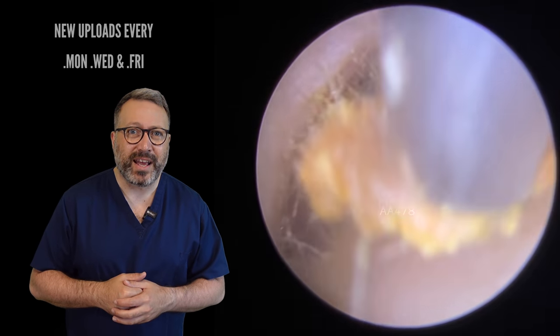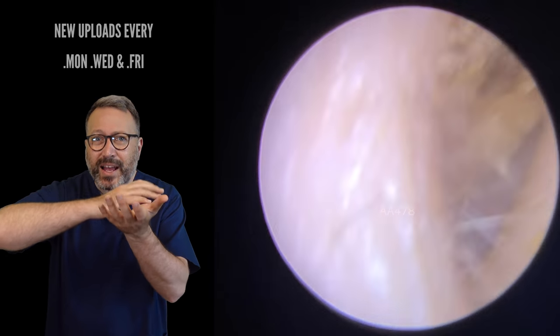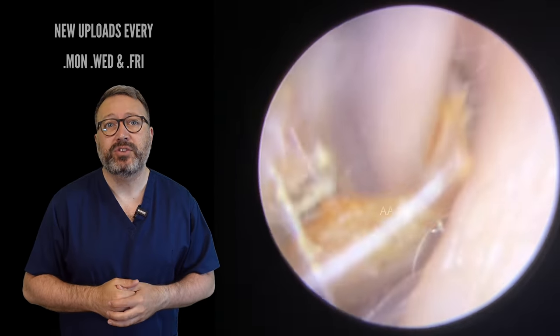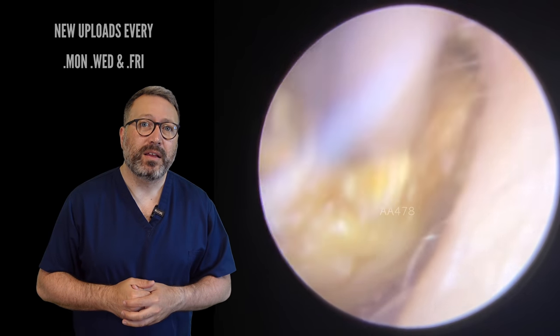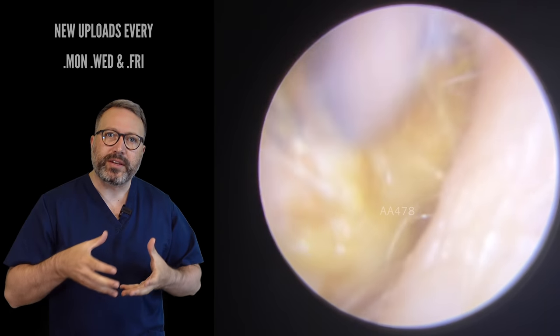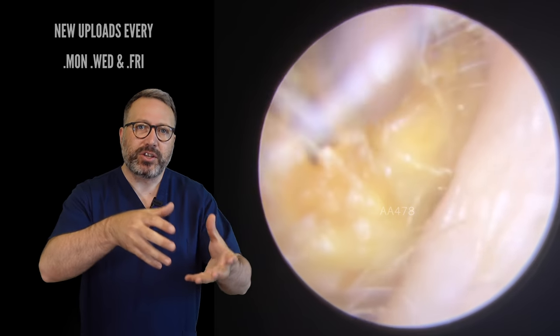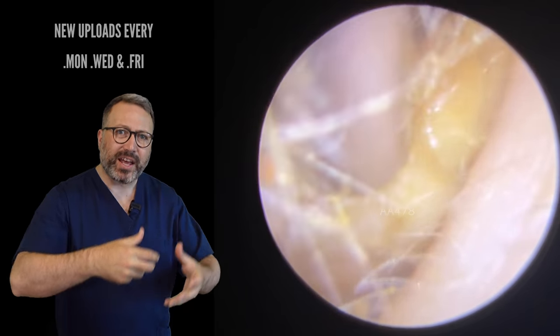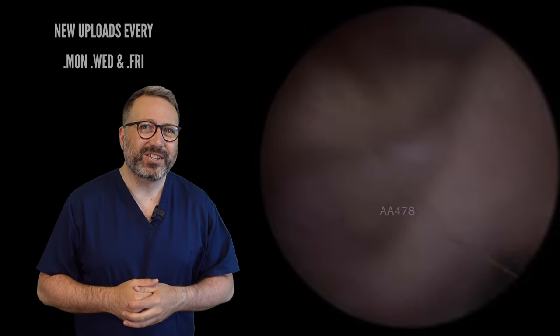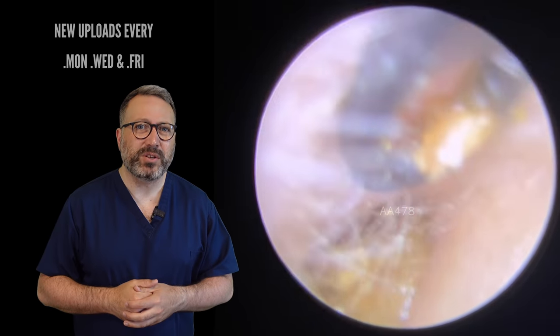Really trying to get that next section. You can see that whiter underlayer there — that's another piece of dry skin just underneath there. We're just wiggling away from the canal wall and drawing slightly down the side, slowly working this next section to the outer part of the ear canal. You can see it's just got a little bit softer. Let's go in with the Jobson horn now.